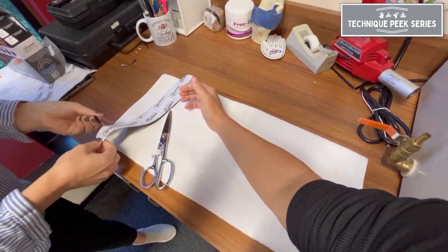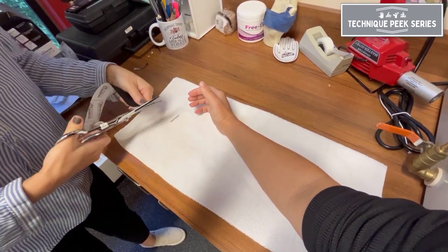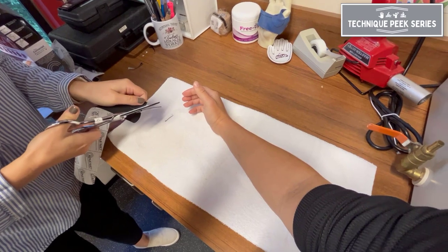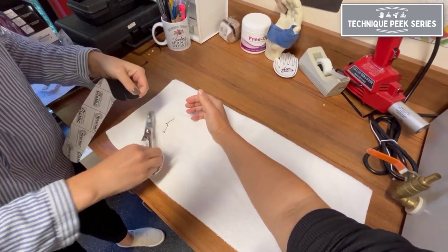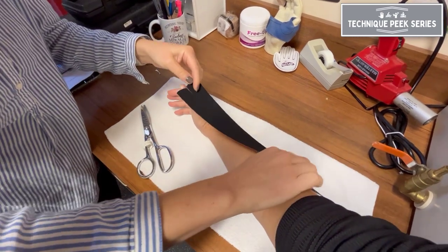Then cut a small piece to create two short tails. Be sure to round the edges of your tape to ensure better adherence. Also be sure to cleanse the skin by removing any lotions or oils prior to tape application.